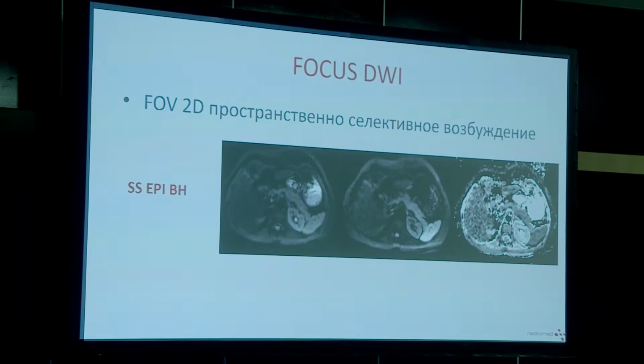So next, I'd like to show you an example for diffusion-weighted imaging. The conventional technique employs single-shot EPI, echoplanar imaging, for diffusion-weighted imaging of the upper abdomen. And as you can see here, for example, you can see spatial distortions in regions where there are B1 or B0 inhomogeneities.